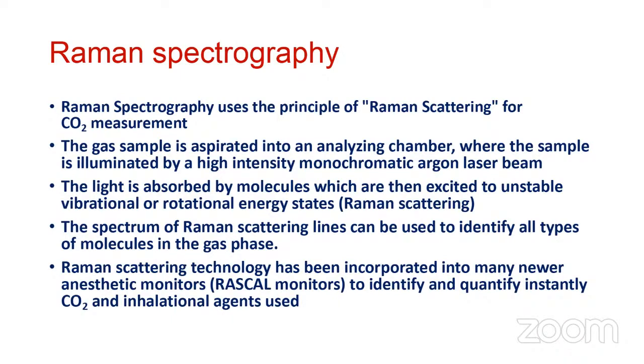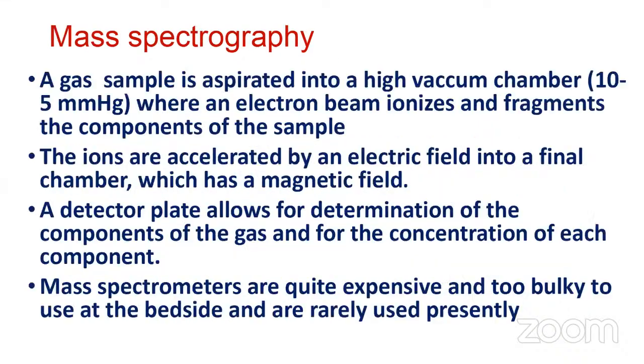The spectrum of Raman scattering lines can be used to identify all the types of molecules in the gas phase. The Raman scattering technology has been incorporated in the newer anesthetic monitors, that is Rascal monitors, to identify and quantify instantly not only the carbon dioxide but also the other inhalational agents that we use during anesthesia.